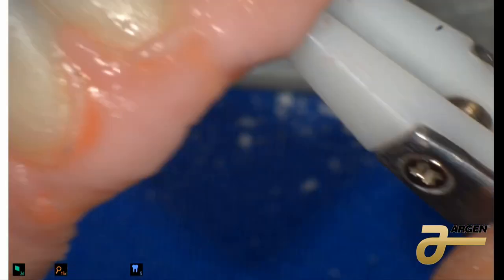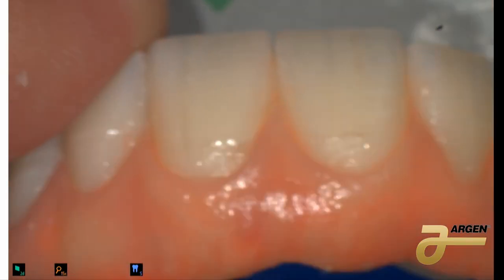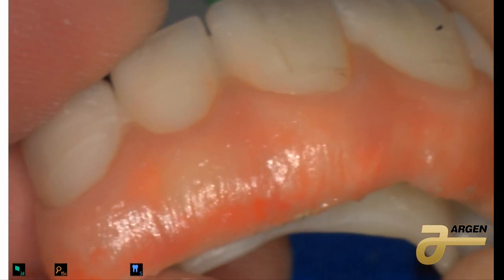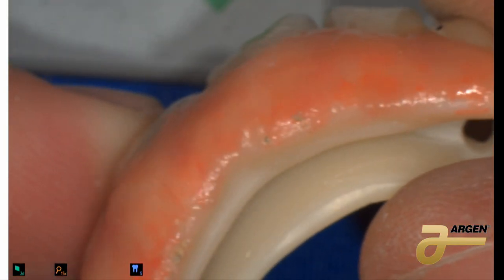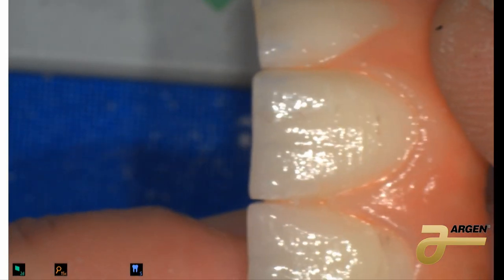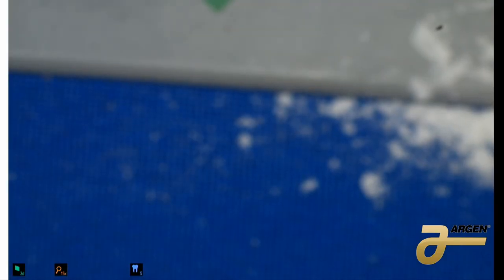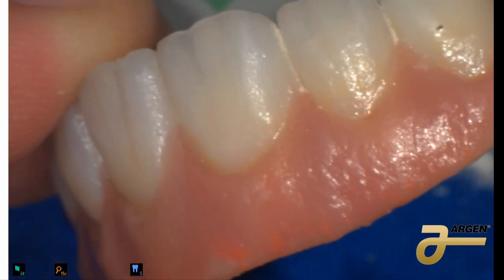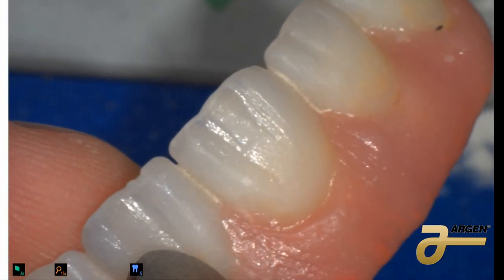After bake, you're going to have something like that. This is another sample I have here so you can see how this material adapts to the color of the tissue. You can change the color — put more or less red — something like that. You can also stain the teeth.